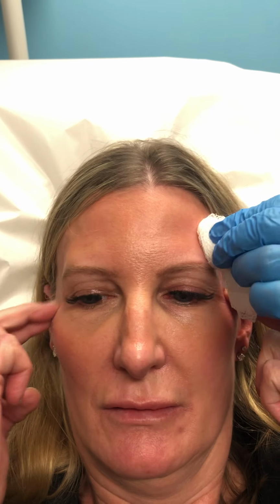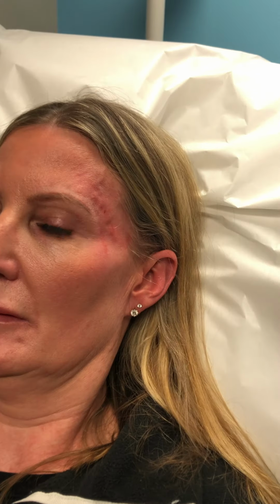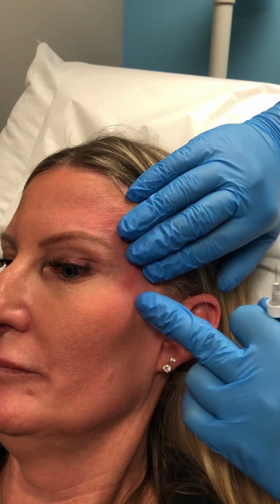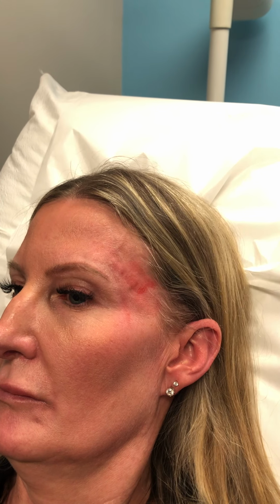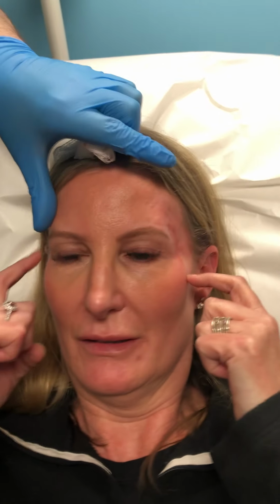So that's it. I mean, it was, what, 2 minutes? Yeah, 2-minute correction here. And this does help. When you fill this area in, you can see what it does to the lower jawline. You can see what it does to the cheeks and to the nasolabial folds. See how all that moves? So just by filling in the temple here can actually help that. And then we'll go do the other side. I mean, this side's not quite as bad. Yeah, I was gonna say, but even if you run your fingers, now fill each side.